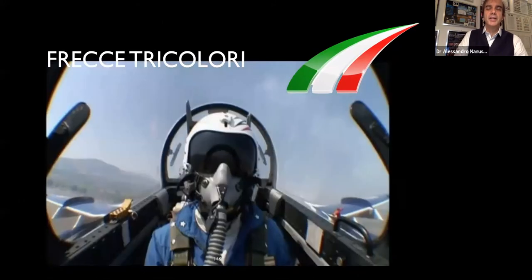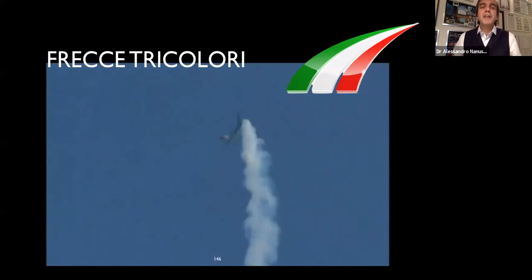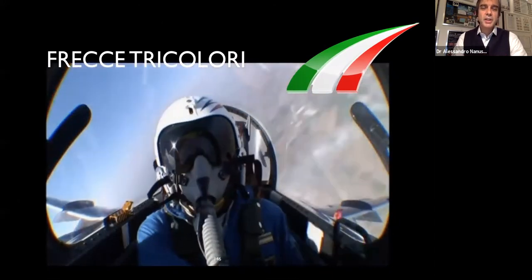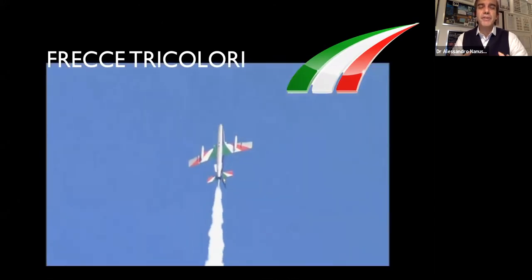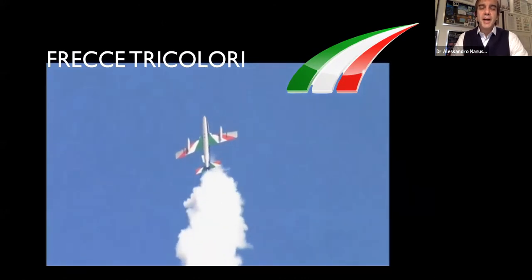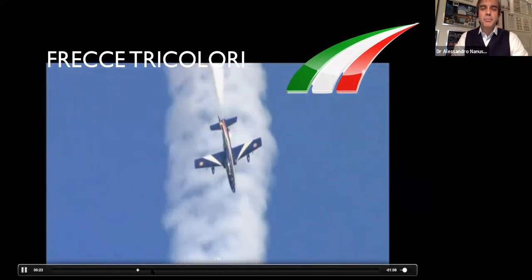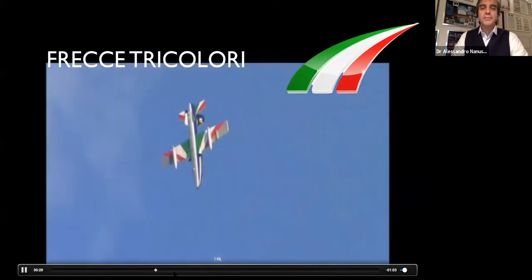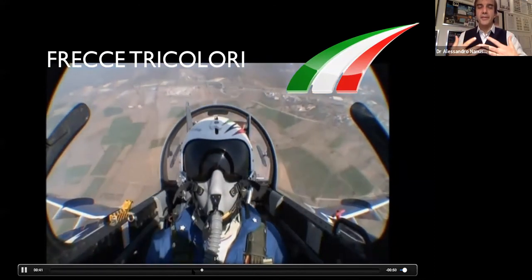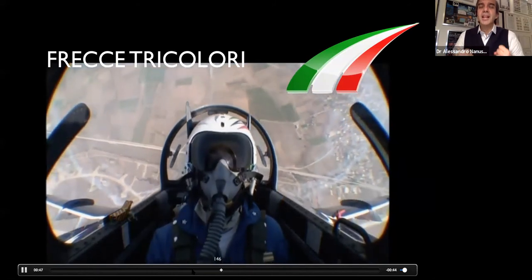some clinical and instrumental analysis because they have a very, very strong power of clench. They have also emotional stimulation, so they need to have an occlusion very, very stable. You can see this exercise, very dangerous. Then you can see the emotion of the pilot when he goes. Okay, look at his breath. He's very emotional, he's very stressed, so I'm sure he's clenching.